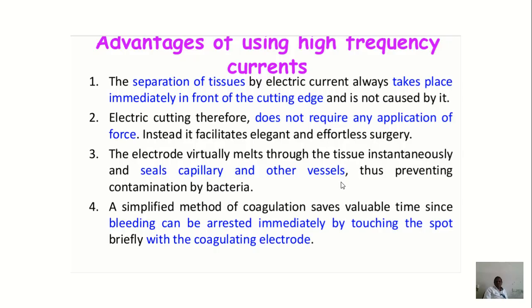The electrode virtually melts through the tissue instantaneously and seals capillaries and other vessels, thus preventing contamination by bacteria. In an ordinary cutting operation, bacteria grow on the cutting edge, the point of operation, and the tissue is contaminated.